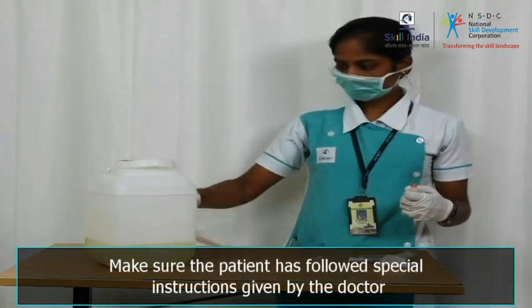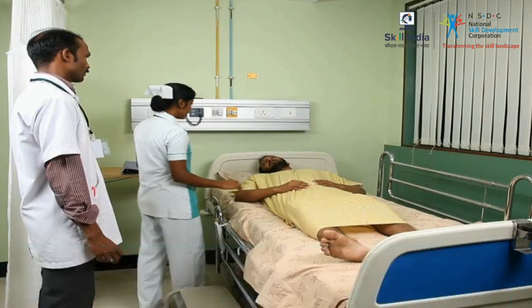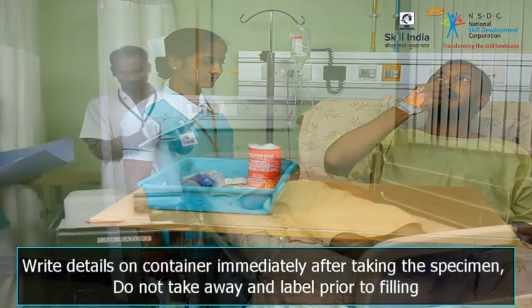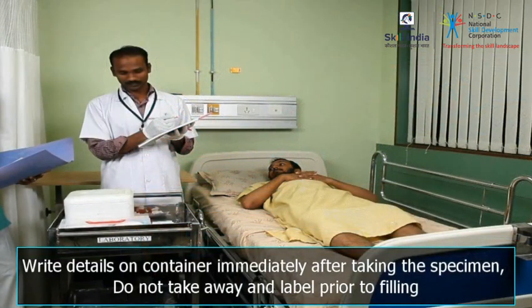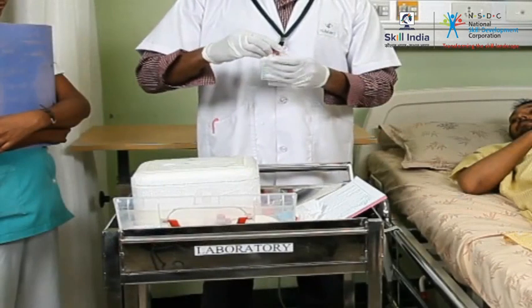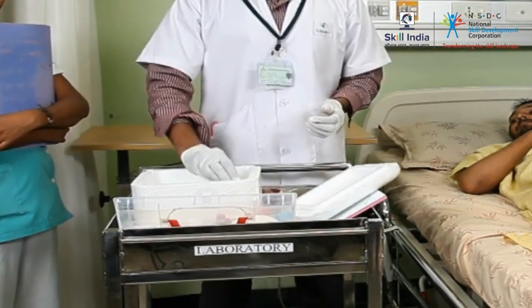Make sure the patient has followed any special instructions, which could include fasting for a number of hours or taking a medication at a certain time. Write details on the container immediately after taking the specimen. Do not take it away and label it prior to filling. Details should include the patient's name and date of birth, and the type of specimen. The specimen should then be placed directly into the clear bag and then into the specimen transport container.